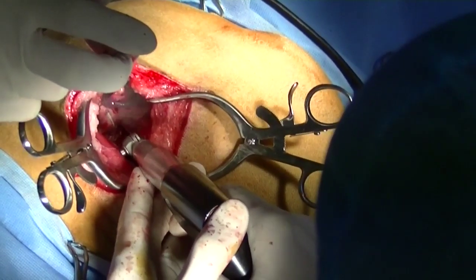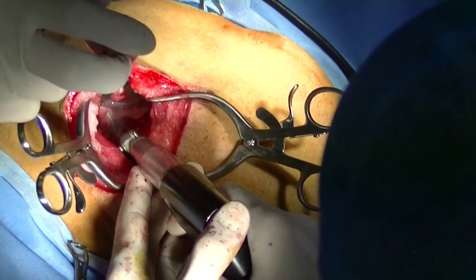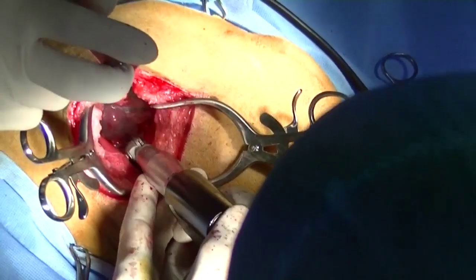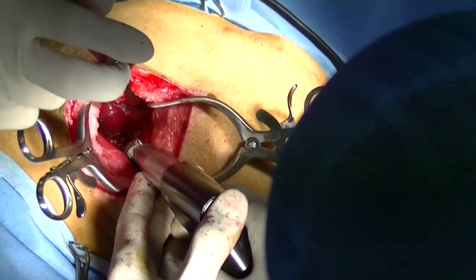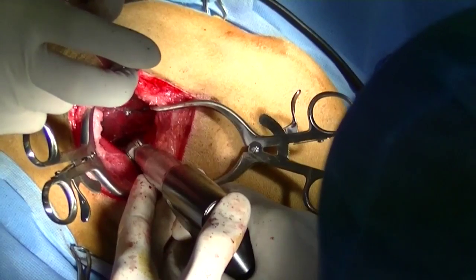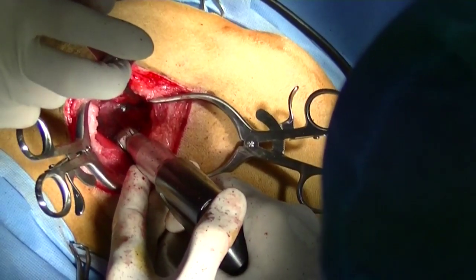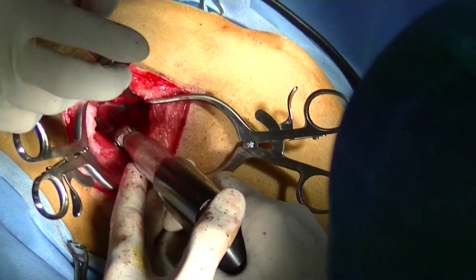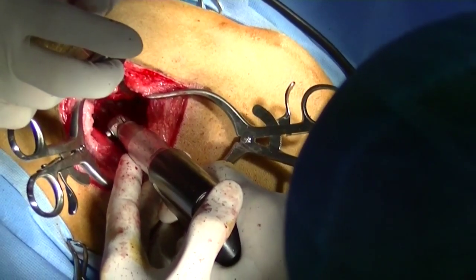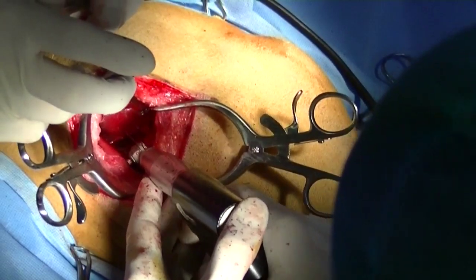In order to protect the sciatic nerve, I cut the lateral cortex of the ileal wing and the ventromedial cortex of the ileal wing, but not the dorsomedial portion of the ileal wing because that's where the sciatic nerve is going to be. To make that portion of the cut, I use an osteotome and mallet and very delicately cut that area of bone.